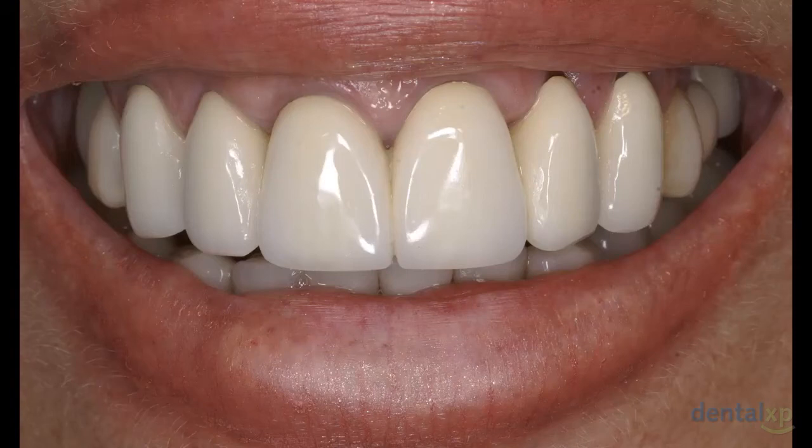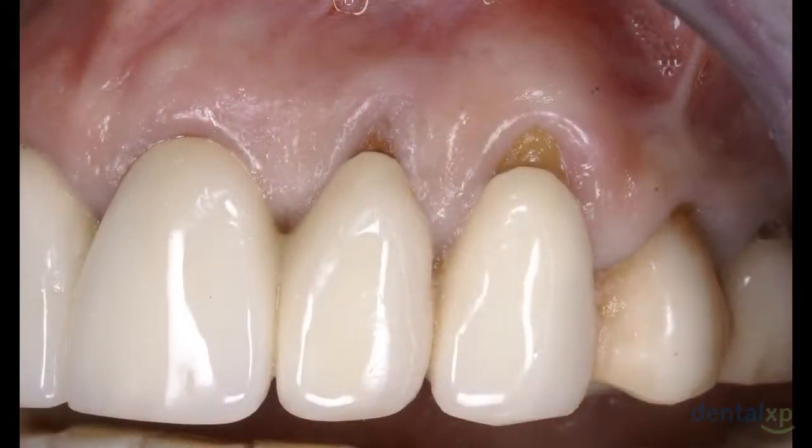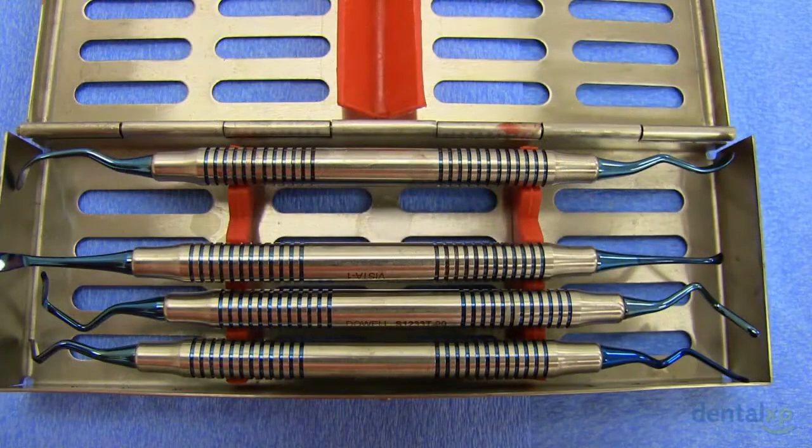I'm Dr. Maurice Salama, and I'm going to be discussing with you a case, as you see here, on a frontal view of a patient with existing crown and bridge work, recession that has caused her some aesthetic concerns in the area of the maxillary left lateral and left canine teeth. This is a common issue in modern dentistry and often is a concern not only because of aesthetics but also in terms of erosion and sensitivity.